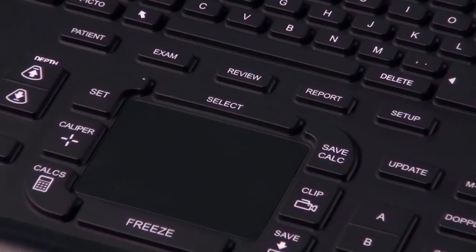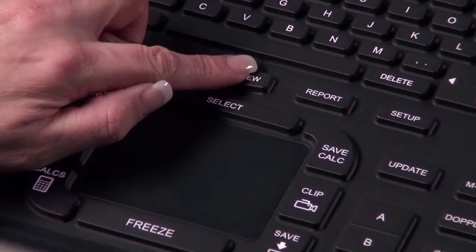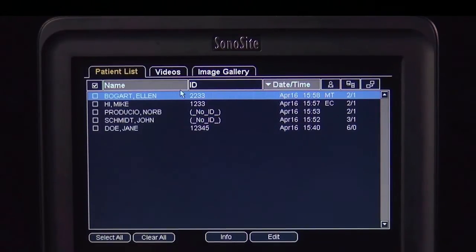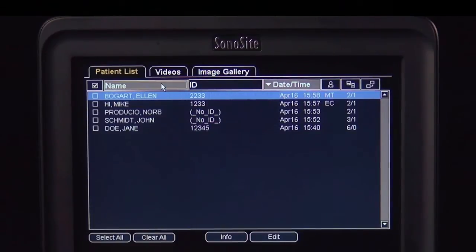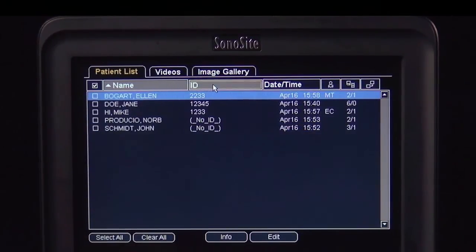Press the Review key to view a patient list. The patient list displays all exams stored on the internal storage of the ultrasound system. The list can be displayed alphabetically or by the order of archival: A-Z, Z-A, or most recent or earliest.